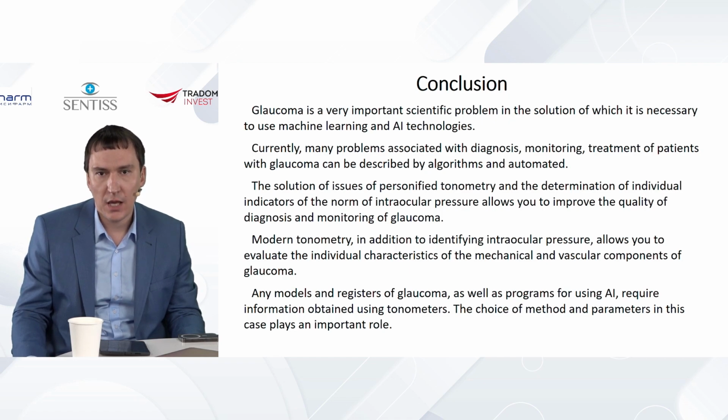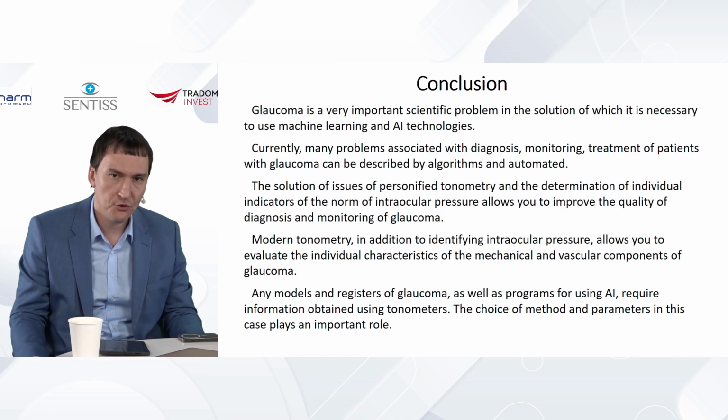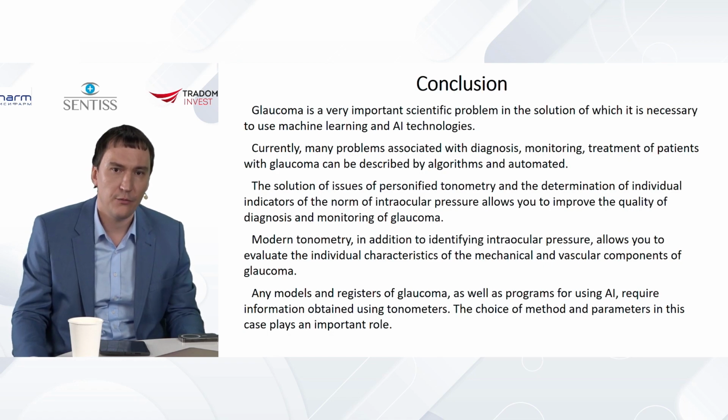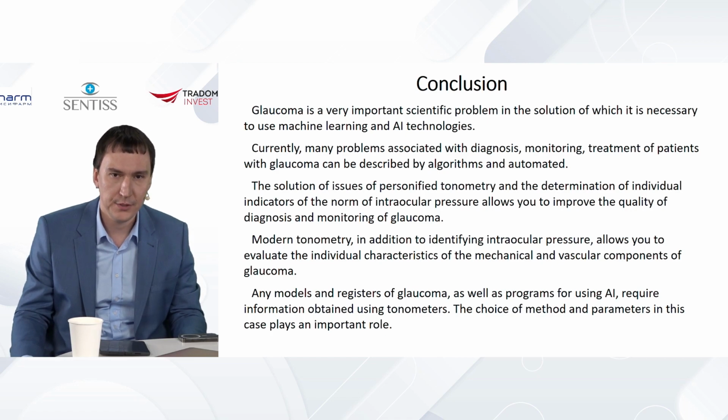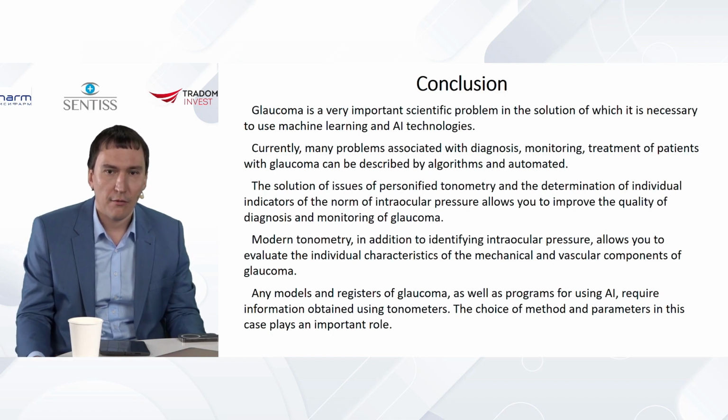But we fully understand that the diagnosis of glaucoma and the prognosis in glaucoma and the selection of tactics of treatment in any case are related to this key risk factor. That is why this factor should obligatorily be introduced in the model of AI, and most preferably it is to be analyzed through the prism of individual specificities of one specific patient we are dealing with.